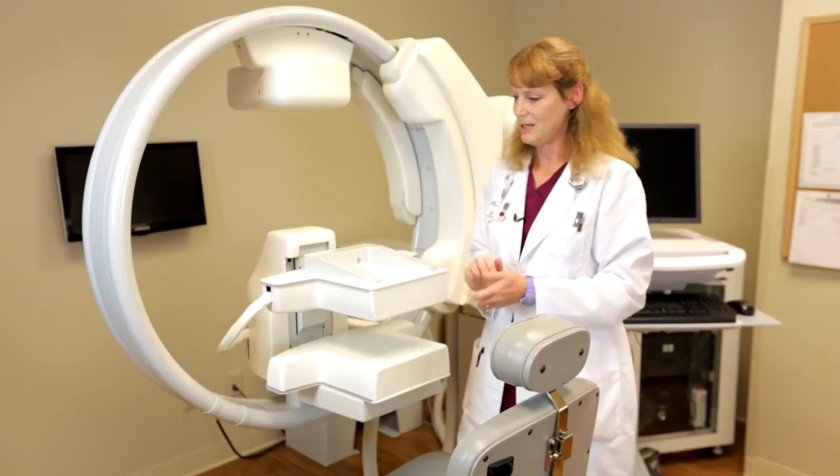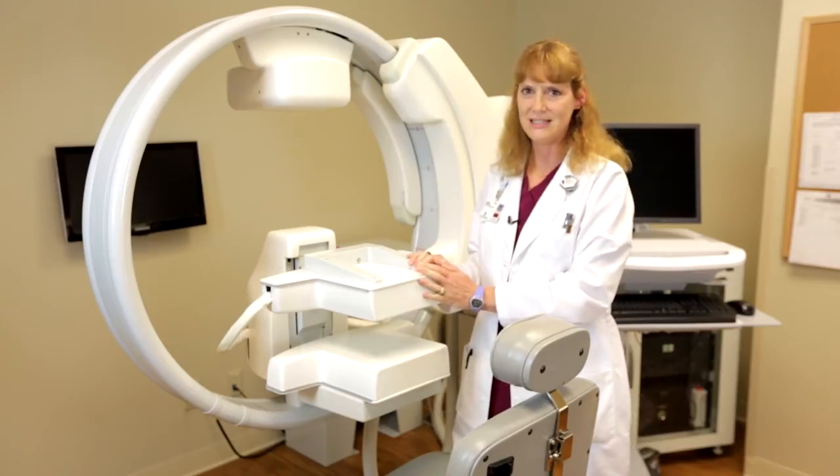While the image is being taken, the camera does not make any noise and it does not move. So the patient is watching television, or we're able to talk with the patient.